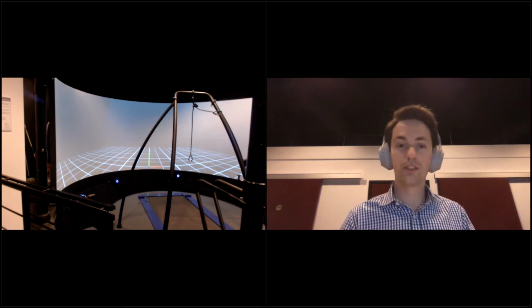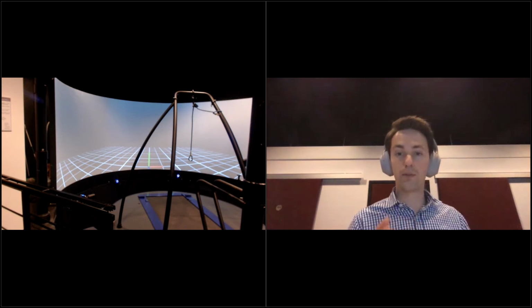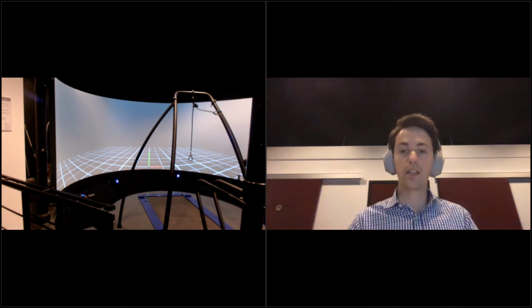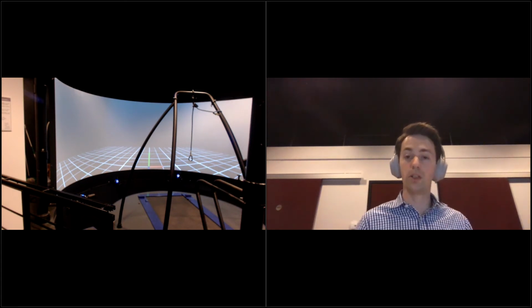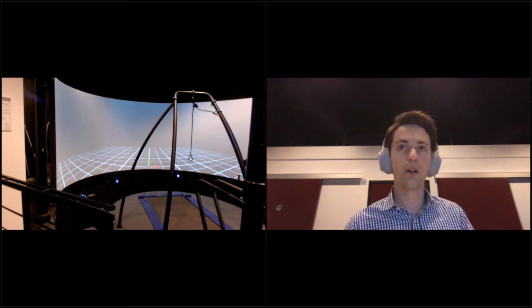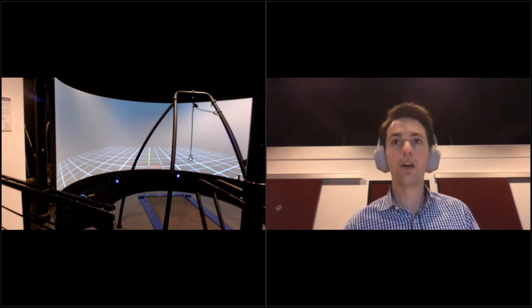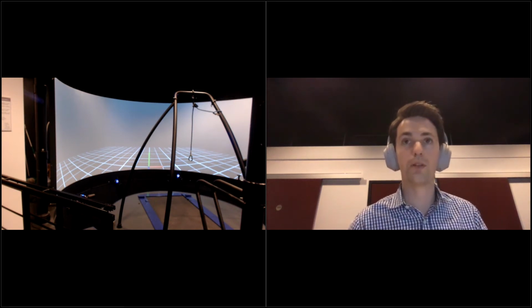So the Caren system you see on the screen consists of several hardware components. We have a platform, and a patient or participant in a research study is standing on top of that platform, and that platform is on top of a motion base. So there are pistons underneath the platform that allow us to move that platform in all possible directions. So it can translate to left, right, up, down, forward and backward, but can also rotate in all possible directions. And as you can see on the platform, there's also a treadmill integrated. So we can also make a subject walk through a virtual environment.